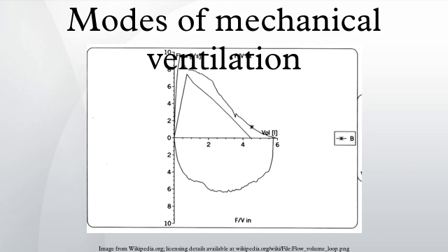Pressure support. Pressure support is a spontaneous mode of ventilation also named pressure support ventilation. The patient initiates every breath and the ventilator delivers support with the preset pressure value. With support from the ventilator, the patient also regulates their own respiratory rate and their tidal volume. In pressure support, the set inspiratory pressure support level is kept constant and there is a decelerating flow. The patient triggers all breaths.